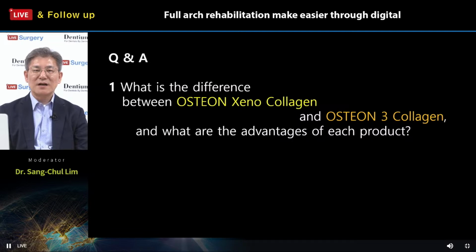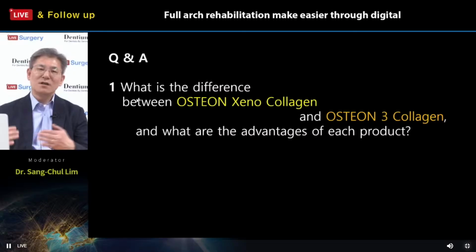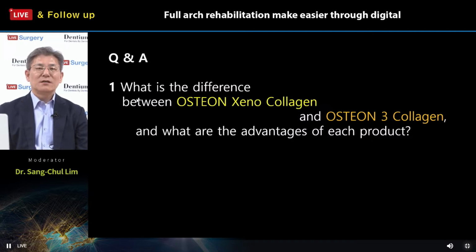However, this xenograft will reduce in volume after 3, 4, 6 months, you know. So to compensate for this reduced volume, I use Osteon 3 collagen.